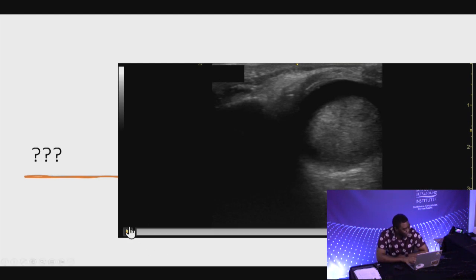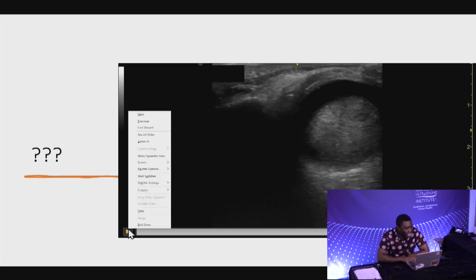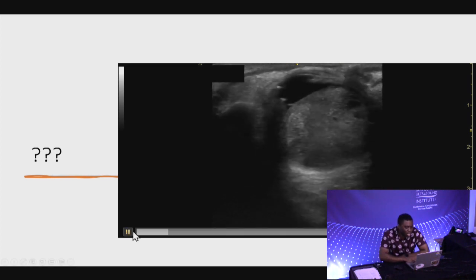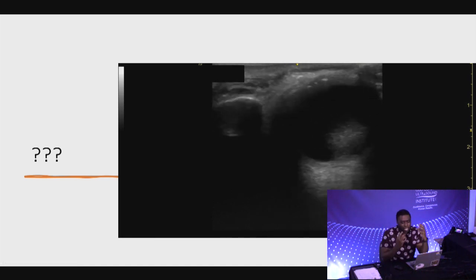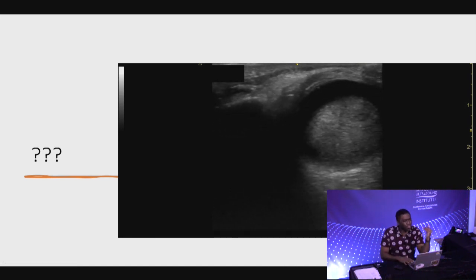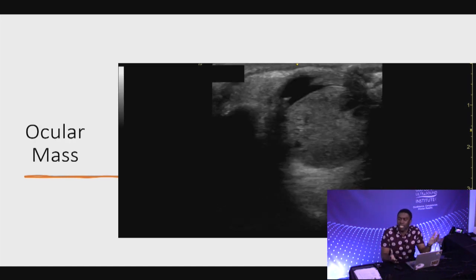Okay, it could be that too. But again, in scanning through the eye, this looks pretty homogeneous, right? It almost looks like a consolidation. Like to me, the story doesn't fit, right? You have this huge thing in your eye that supposedly took some time, and you said there was no trauma, nothing acute that could have caused this. It looks nice, it looks compact, and it looks homogeneous.